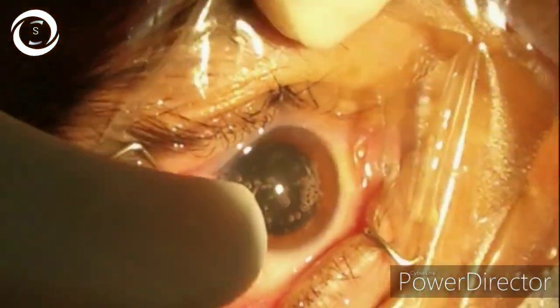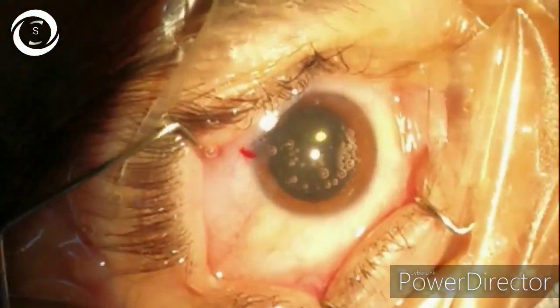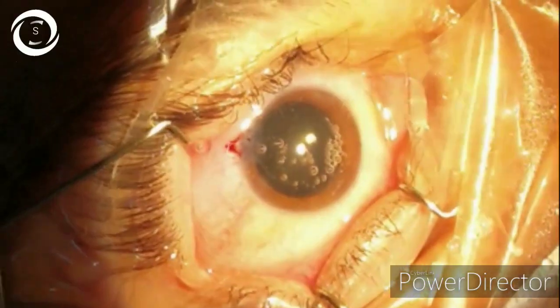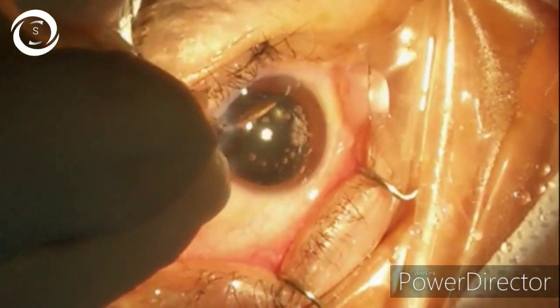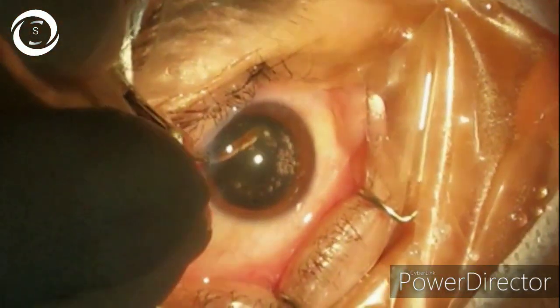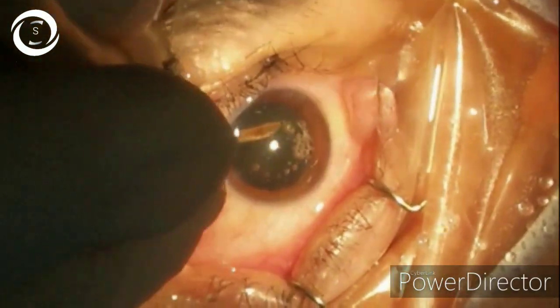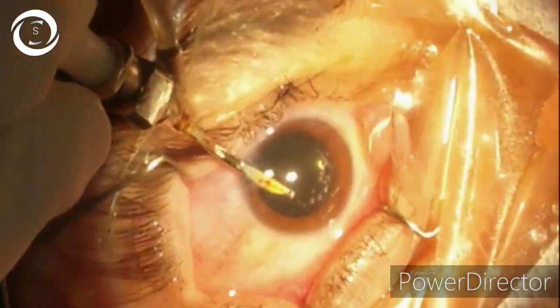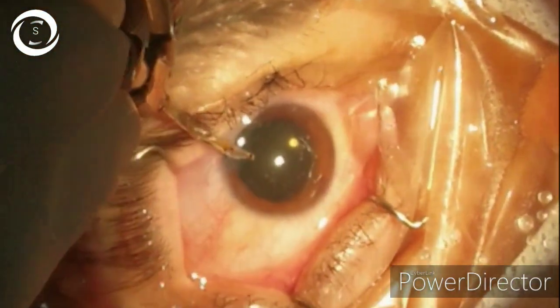The IOL has been placed into the bag. You should also counsel the patient that they should not undergo YAG capsulotomy before 360-degree retinal laser barrage. Try to gently remove any remaining cortical sheets now that you have intraocular lens support. Remove all the viscoelastics. At the end, you can put intracameral antibiotic — cefuroxime.